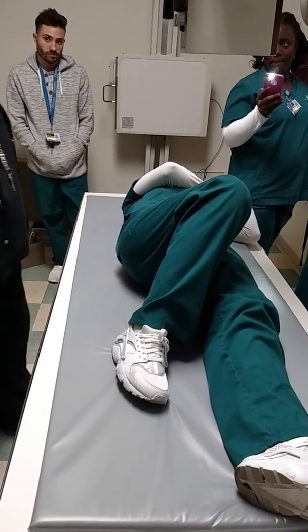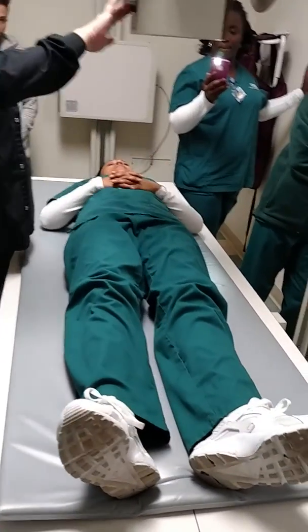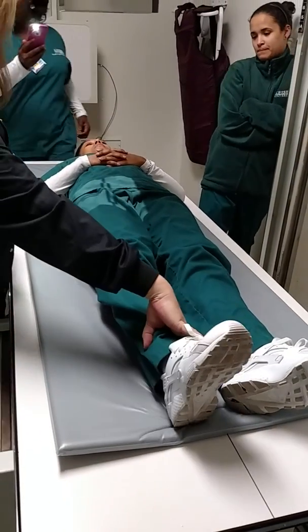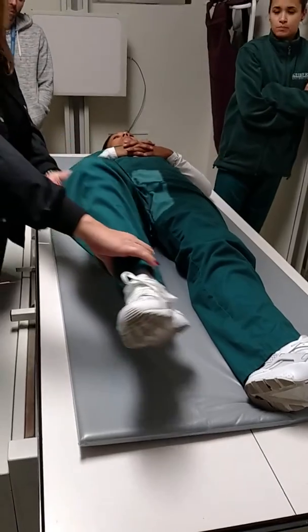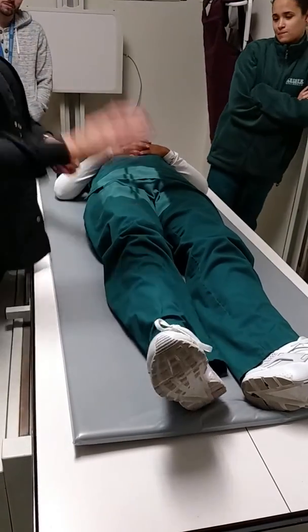Axiolateral hip. Oh, last one. Okay, flat down on your back. So what do we want to do if we're doing someone's hip x-ray? Don't we want to do AP and then we want to do lateral? So she's here and I did AP, and then when I went to do this, she's, ah! Okay, we'll leave that there.